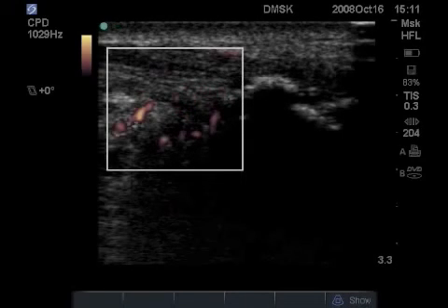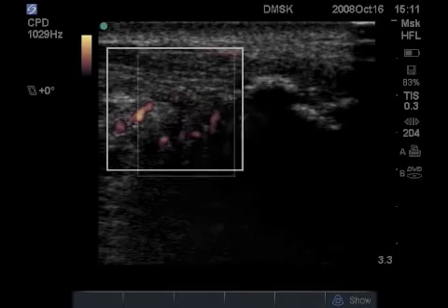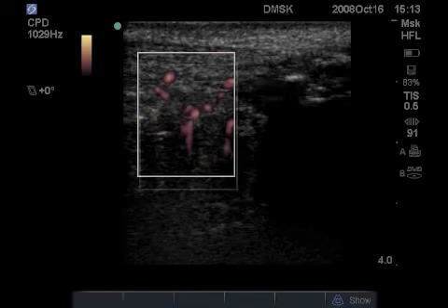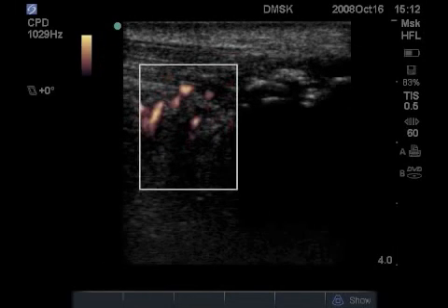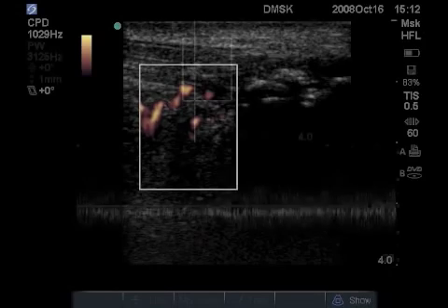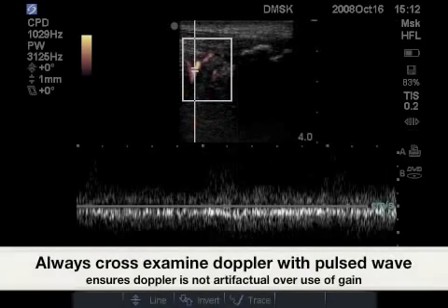When utilizing Doppler, multiple sites should be sampled to ensure that this is not noise due to high gain. Also, use pulse wave Doppler to ensure that this is truly flow.